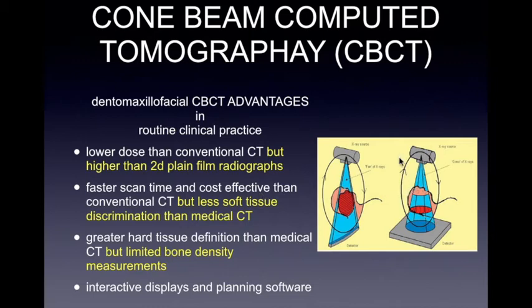Yes, it has very good definition in terms of its hard tissue. You could see your bone in good detail.